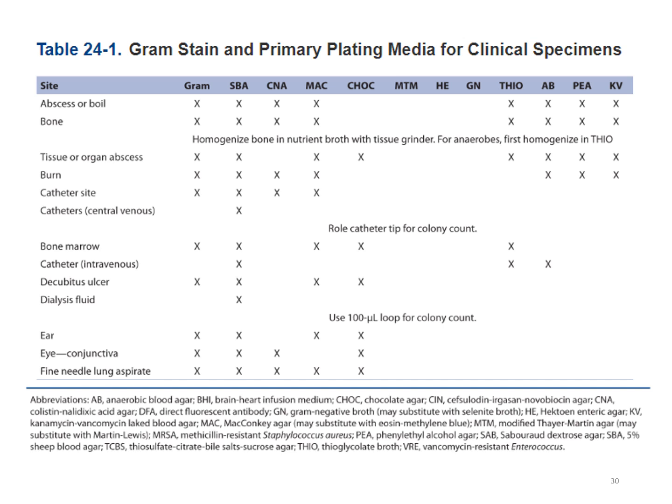And here we have a list of some of those various things that could be cultured. Now, all the things that I've discussed, again, this is not an exclusive list. It's just covering some of the more common cultures that you will see. You can get other things like bone marrow. If they suspect that there's a deep infection within the bone marrow, you could get bone marrow for culture. You could get bone for culture, bone fragments. You could get actual tissue from different sites. So your site or your facility that you're at should have a list that will include various potential sites or sources and what you will need to do for those.